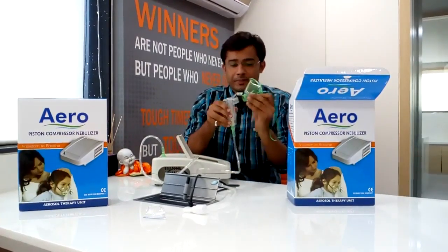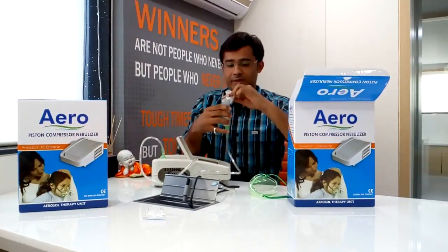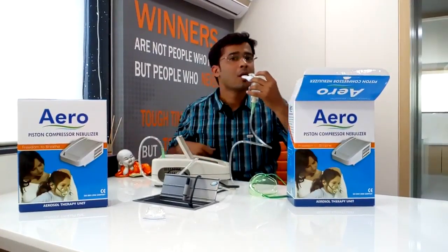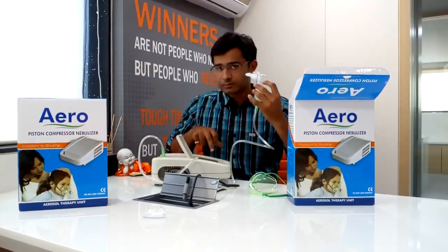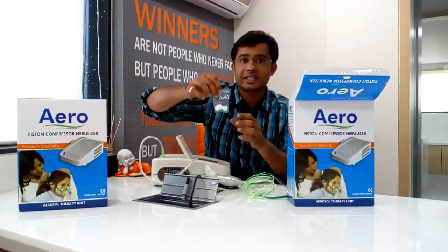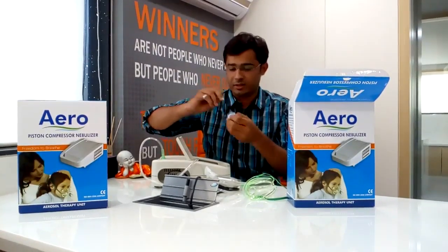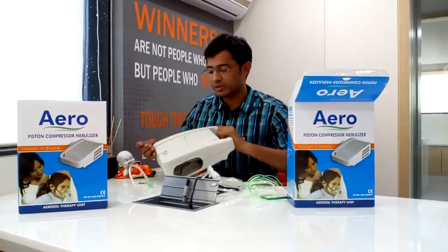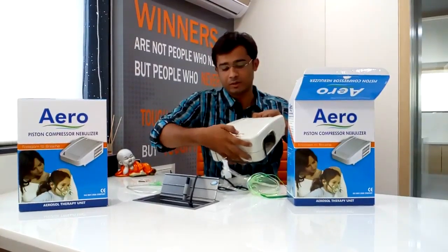Now if you want to take it with a mouthpiece, that option is available as well. If you want to use the filters, they need to be changed. In this compartment, here we have to put a filter.